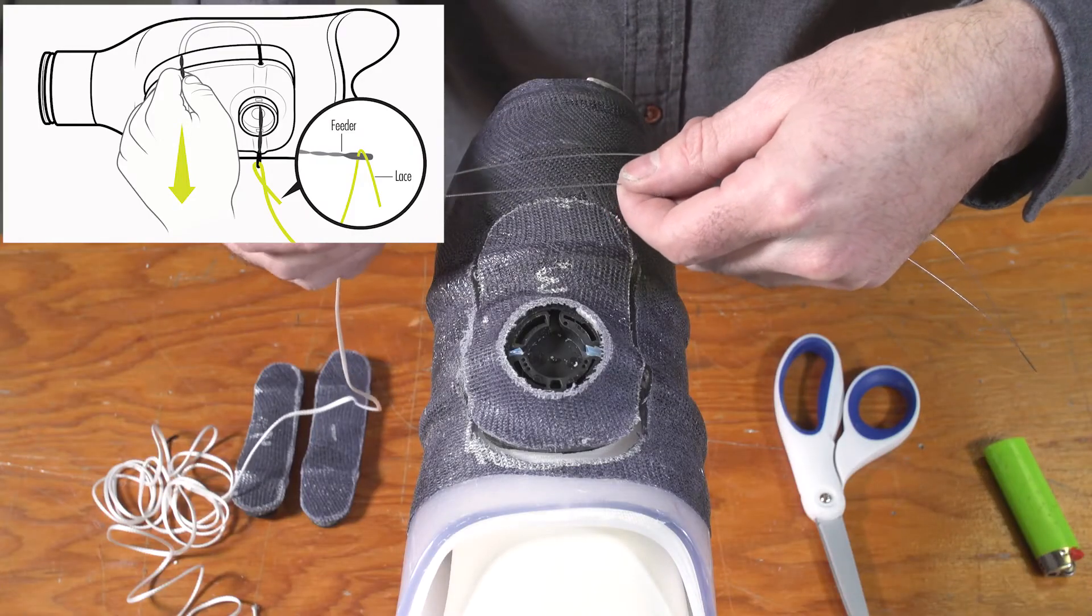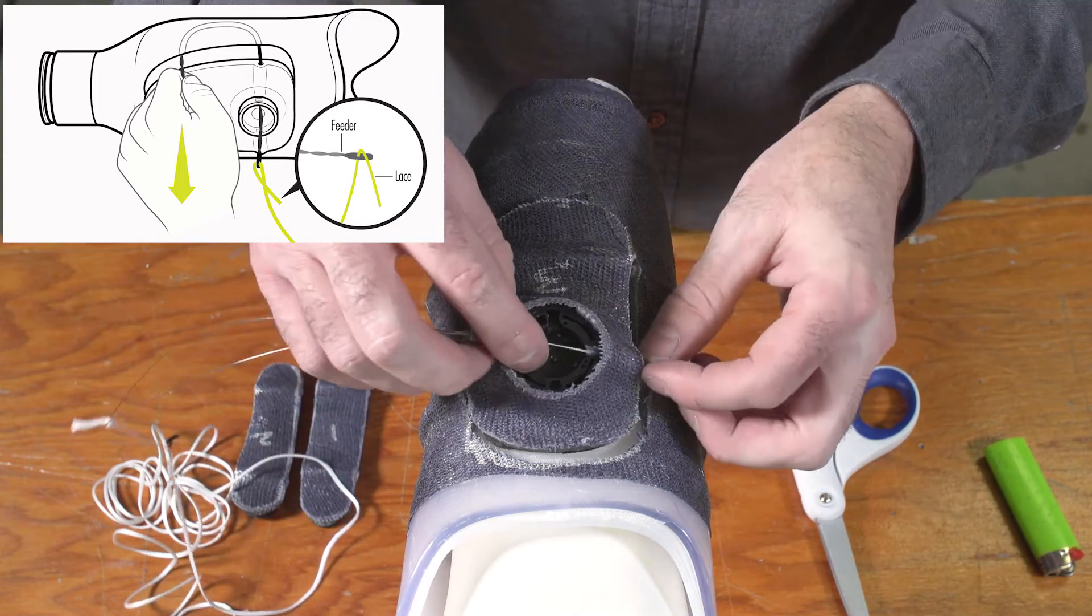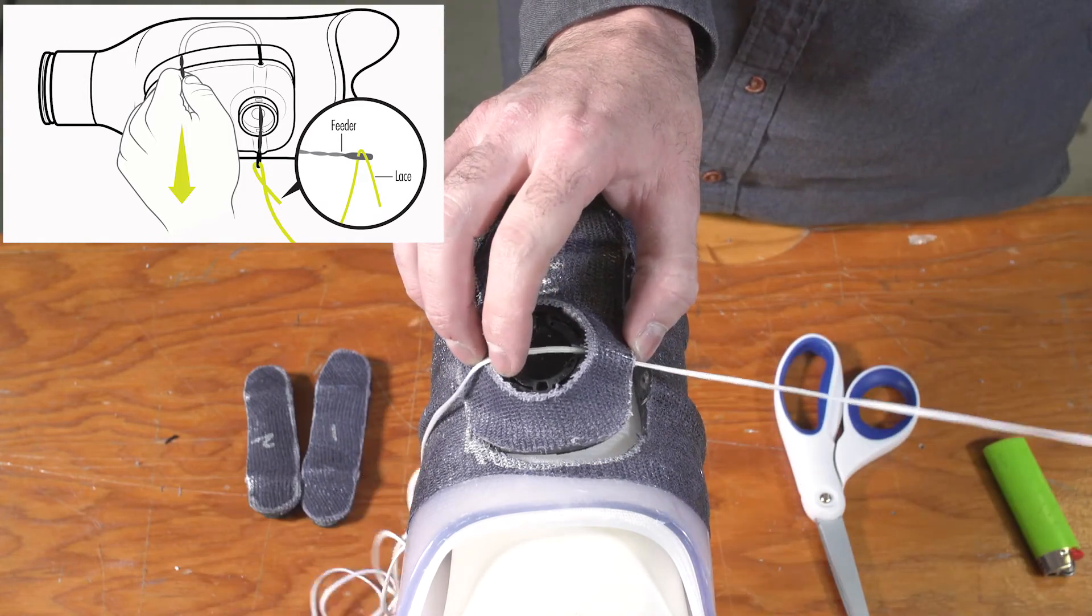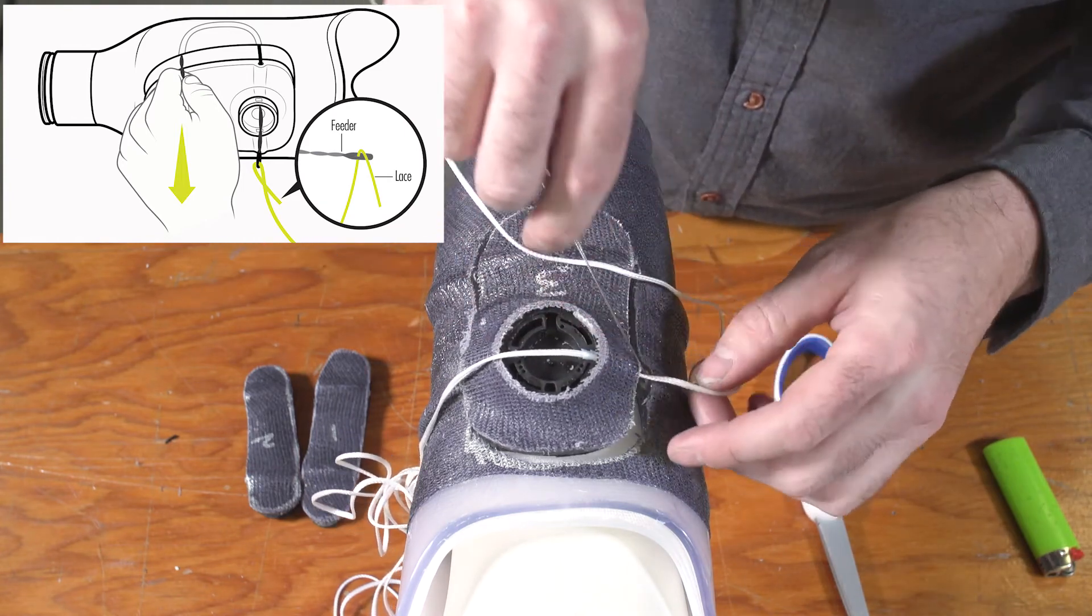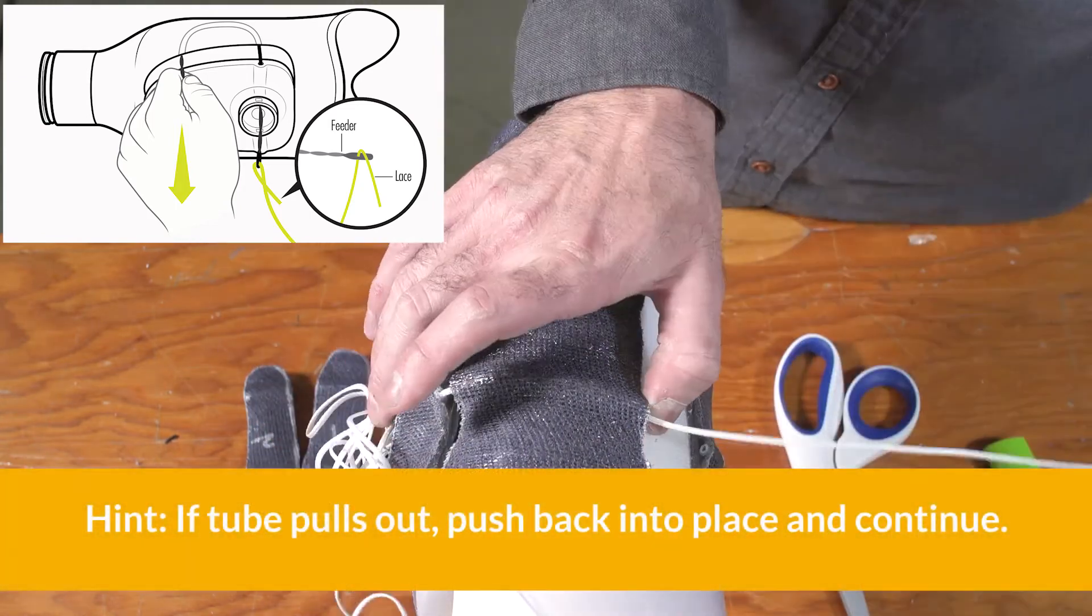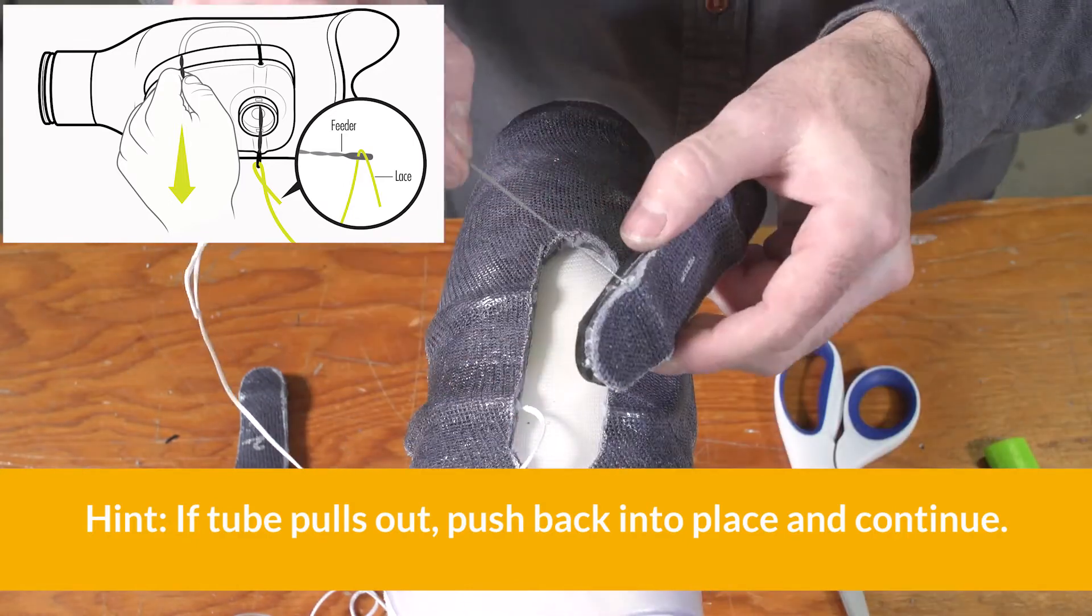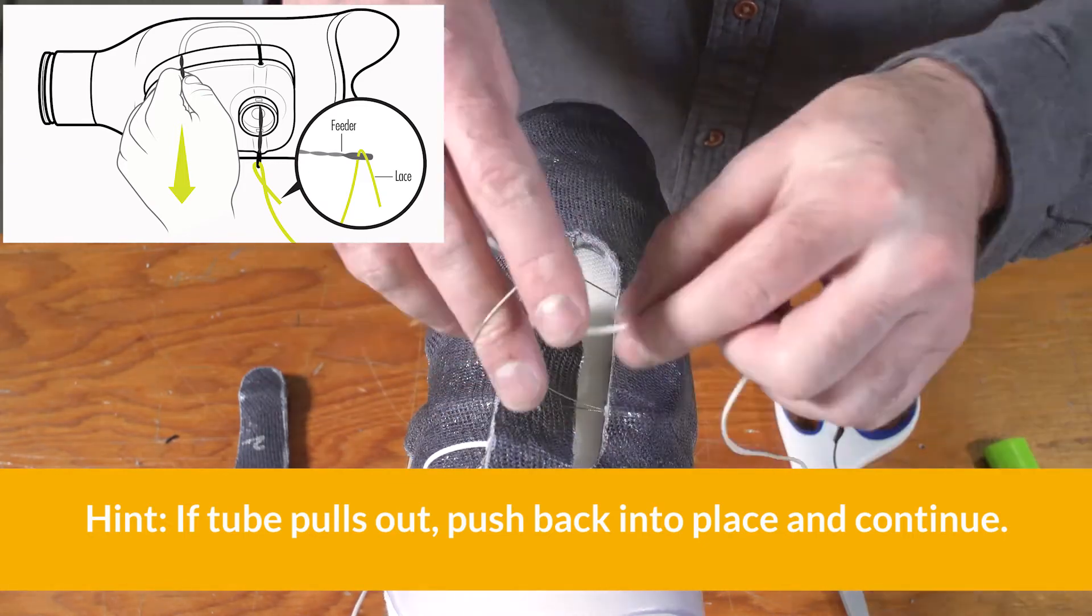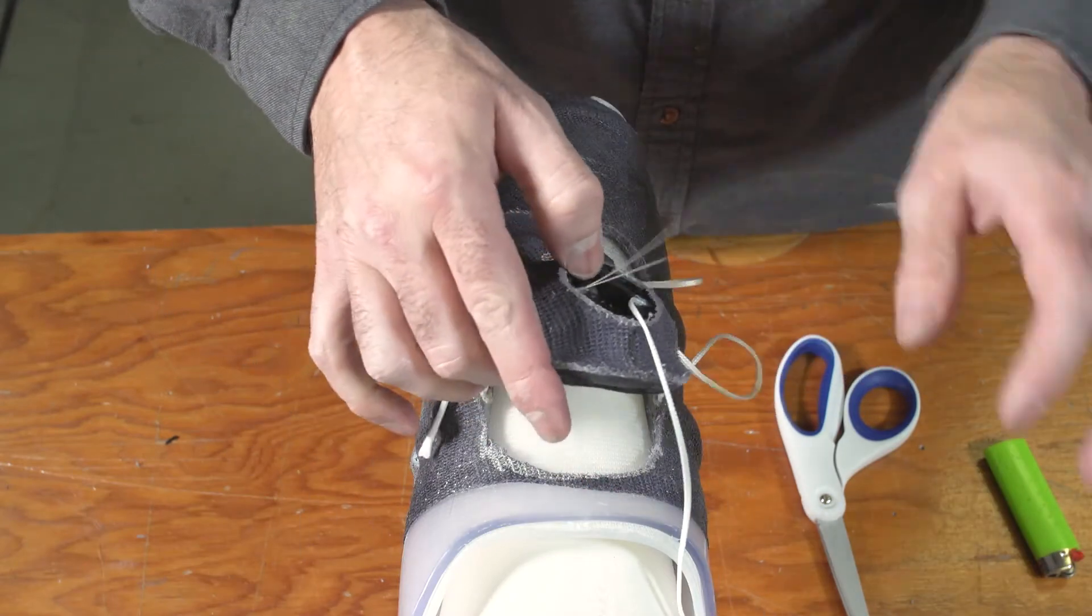Now, thread the lace. Using the wire lacing tool, start from the inside of the dial base and thread the lace through one side of the tubing. At each panel, exit the frame, then enter the corresponding tube crossing the panel. Then enter the frame again. Continue until you've laced each panel and threaded the lace back into the dial base.